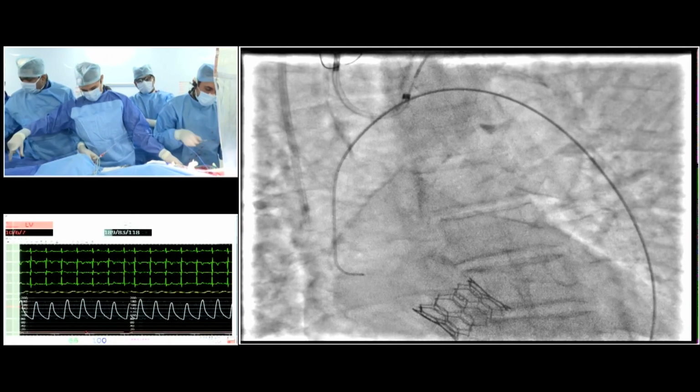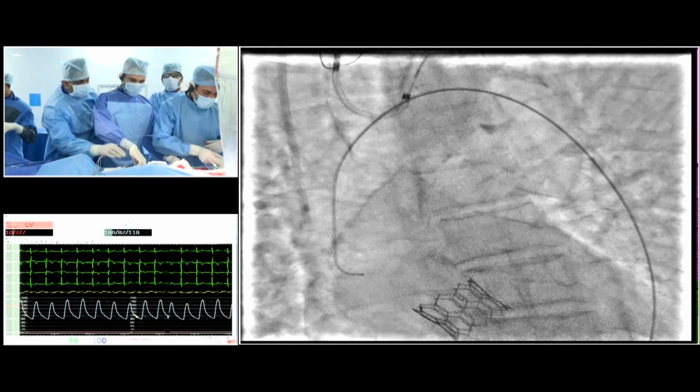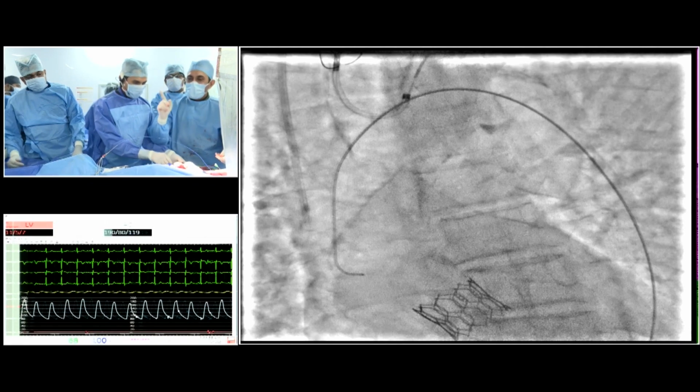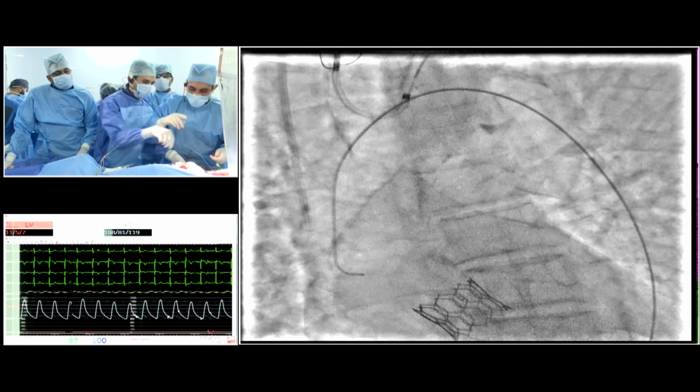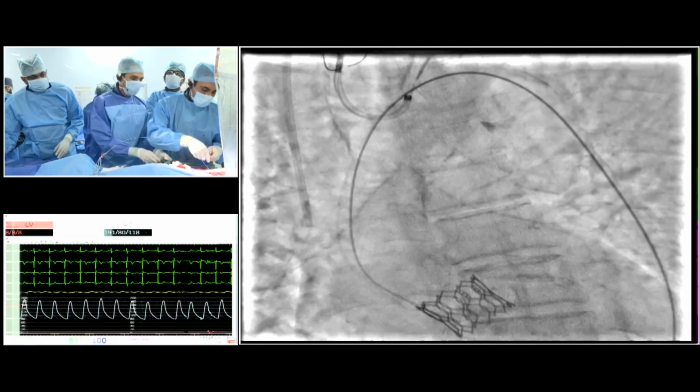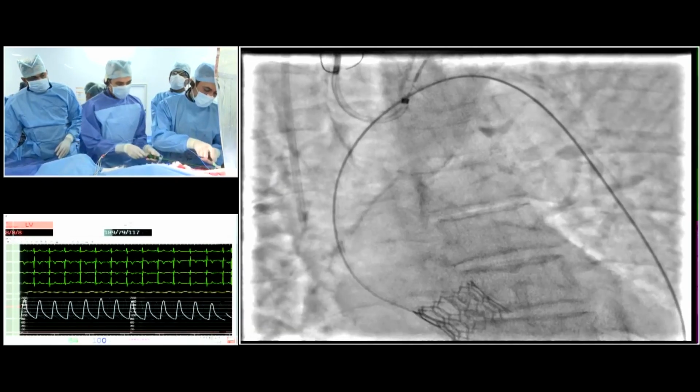We still have 12 minutes and 38 seconds. Maybe you can do another one. So we're going to do the groin closure, and we'll remove the sentinel as well, and we'll have some discussion. Let's put Raj Makar on the spot and go to the microphone and give your impression about this case.